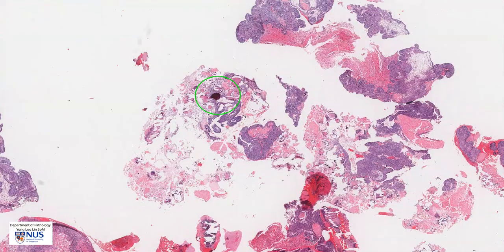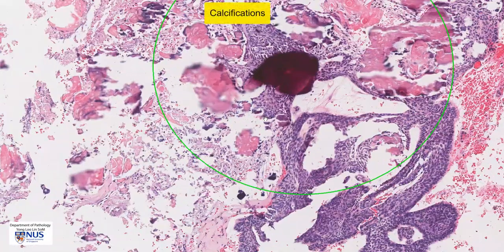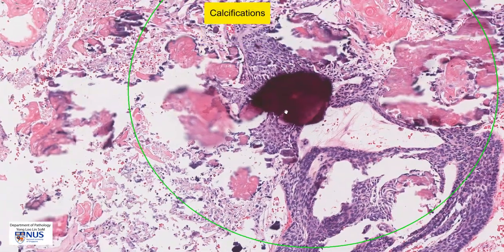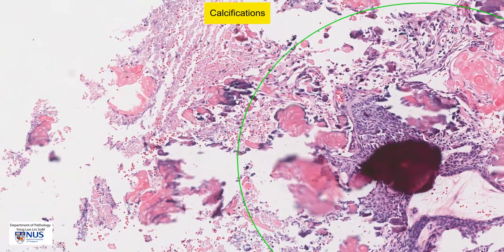This tumor also tends to sometimes form calcified areas or have calcifications. You can see this reddish-purplish chunk of calcified material here. Around it, there is some evidence of this fragmentation or fracturing, and this happens because it's very difficult to cut thin sections as we need to for histology when there is calcification in the tissue.